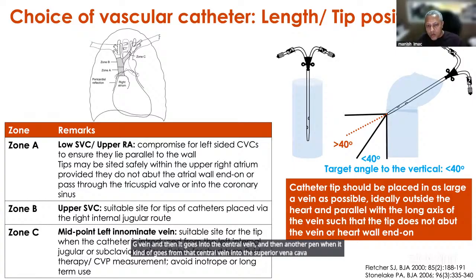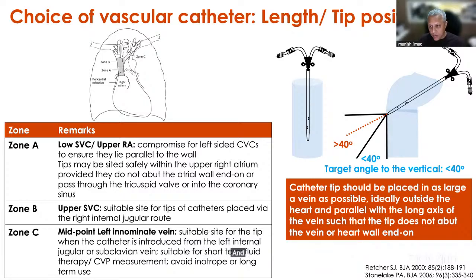Because of these two bends, the turbulence in the blood flow increases significantly as compared to a right IJ catheter, which you can see in the picture here. And then the risk of thrombosis or catheter dysfunction will go up much higher.